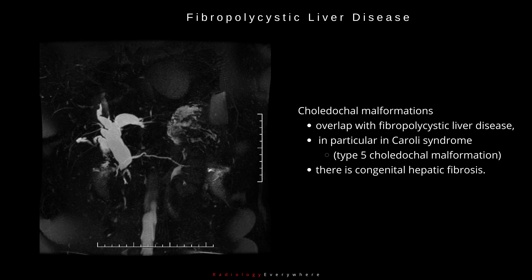Choledocal malformations overlap with fibropolycystic liver disease, in particular in Caroli syndrome, type 5 choledocal malformation, where there is congenital hepatic fibrosis.